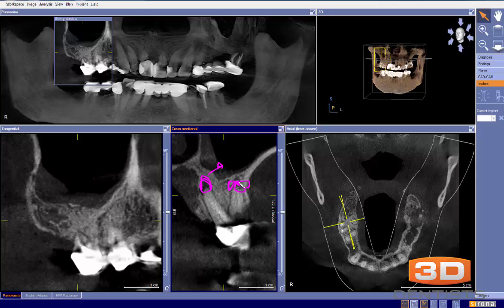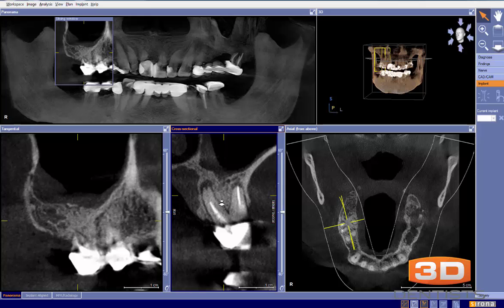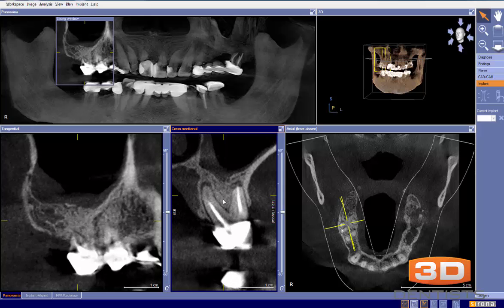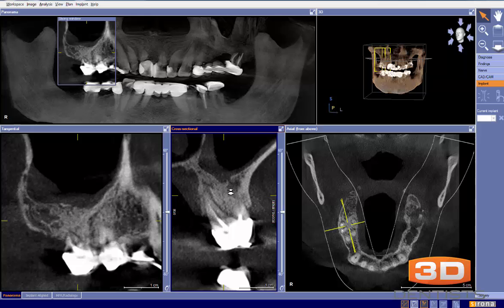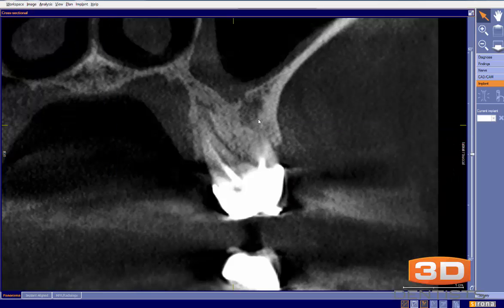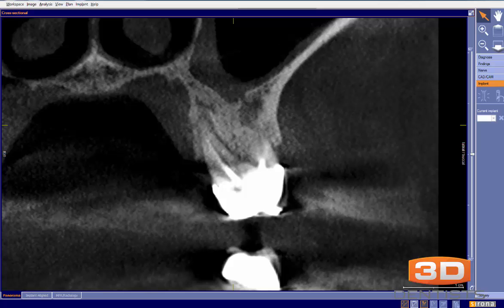My initial read is this is not necessarily related to the sinus, but I keep walking through. As you can see, there's a distinct border between the sinus and the infection. I continue walking through — and then suddenly, when you take a really close look, you can see right here there's a break in the sinus.